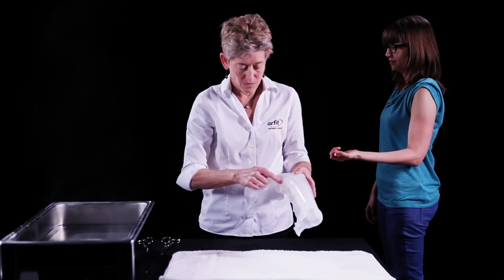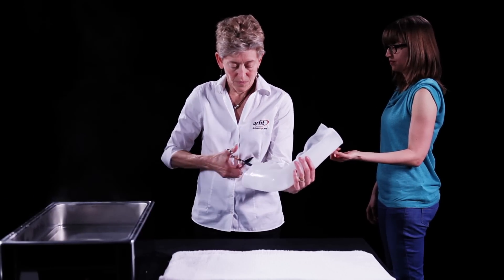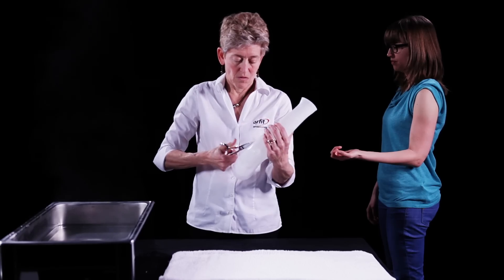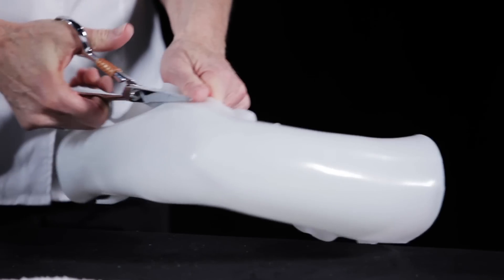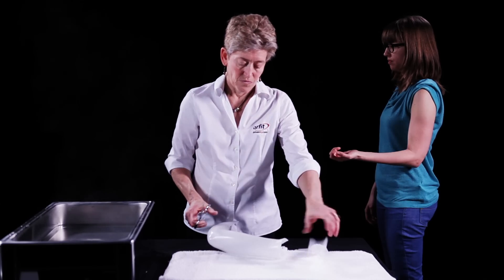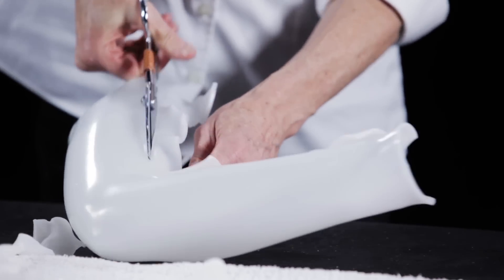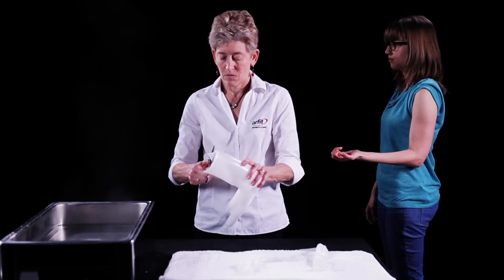Trim away all of the pinched areas. Use long scissor strokes to leave a nice smooth edge. Try to complete the trimming before the material has completely hardened. Round all corners of the orthosis.